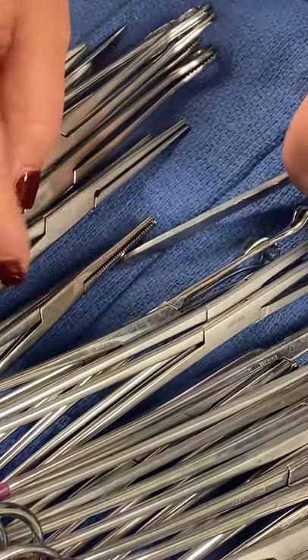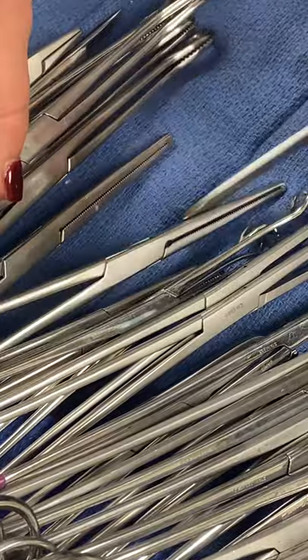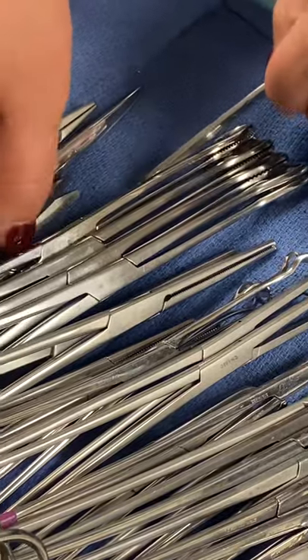I always forget this one — Coker. Coker short, one and two. Coker short, two. Coker long, one, two. Coker long, two. And then sponge sticks, one, two, three, four. Sponge sticks, four.